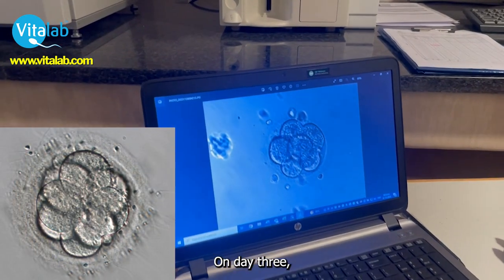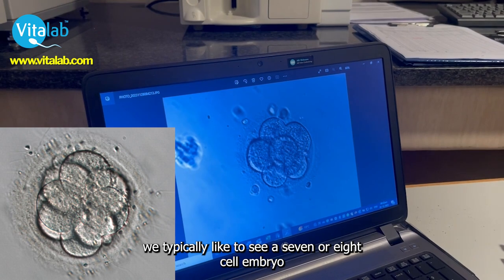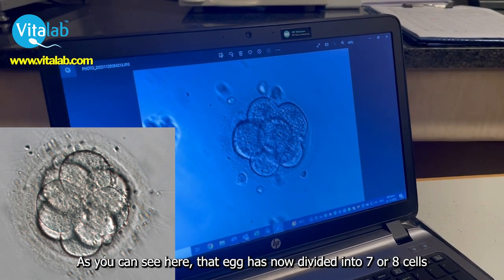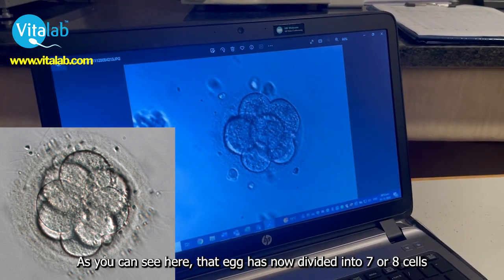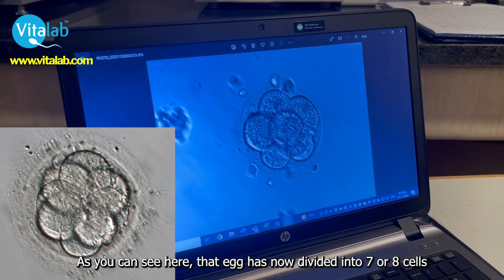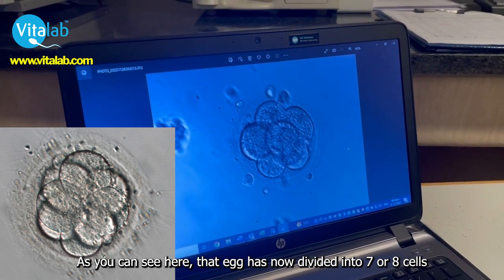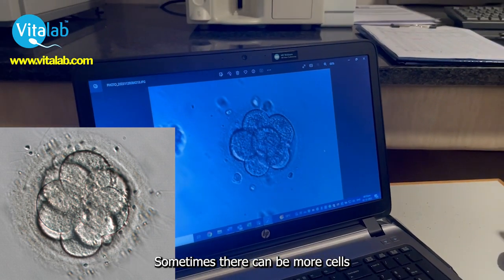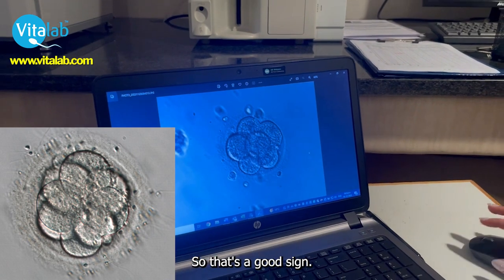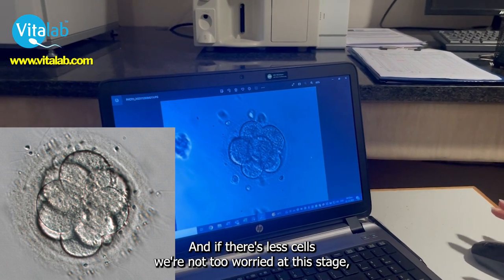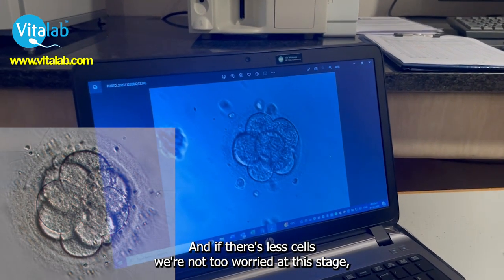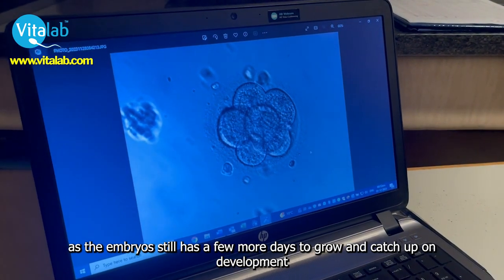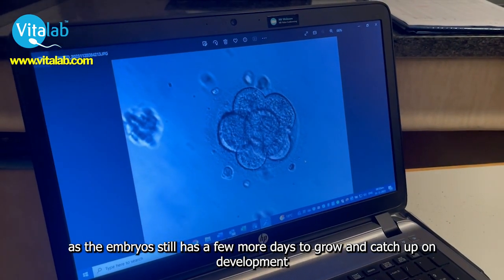On day three, we typically like to see a seven or eight cell embryo. As you can see here, that egg has now divided into seven or eight cells. Sometimes there can be more cells — that's a good sign. And if there are fewer cells, we're not too worried at this stage, as we have a few more days for the embryo to grow and catch up in development.